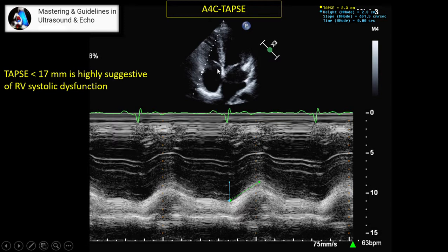Your image should have the cursor almost parallel to the movement of the lateral annulus. Then we measure at a specific spot how much it moves anterior, from the lowest part to the highest part, or just an imaginary line here, how much it moves forward.